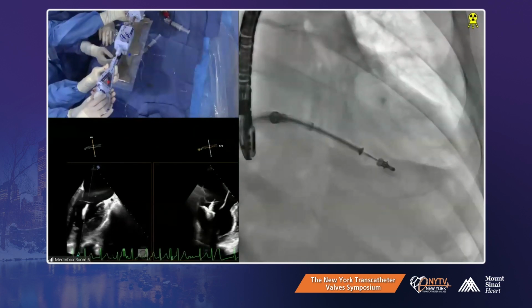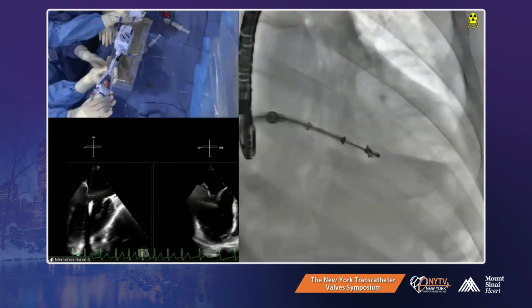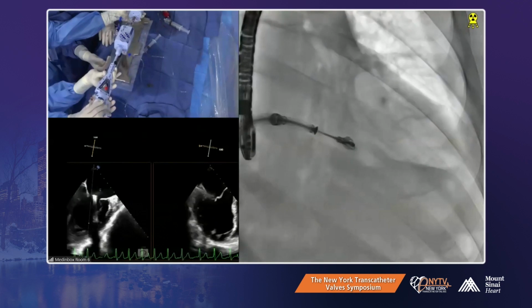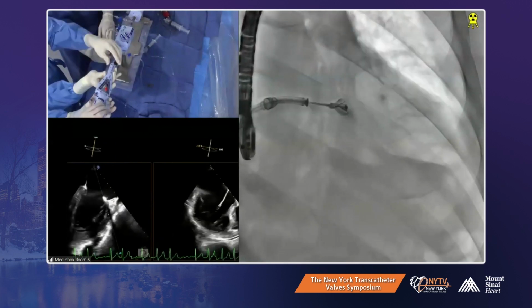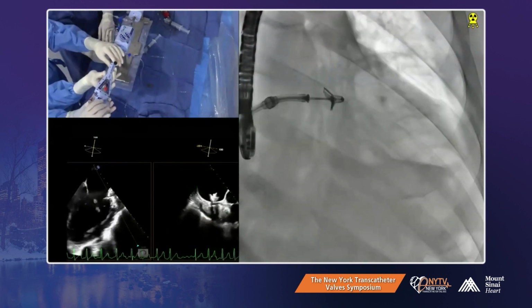While we're doing this, I think you're stuck, wrapped around in the cord. You need to invert the clip. Invert. Yep. Yeah, that's what we're doing right now. Now you're free. Now you can come out. Yep. Come out. Yeah, I know. Okay, that's fine. We'll do it.